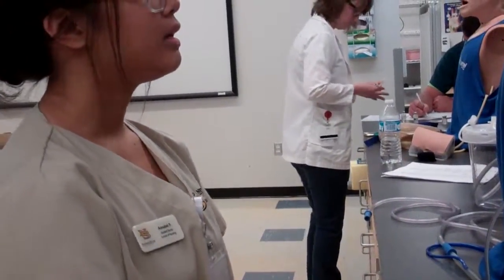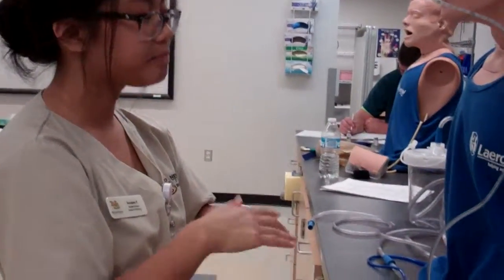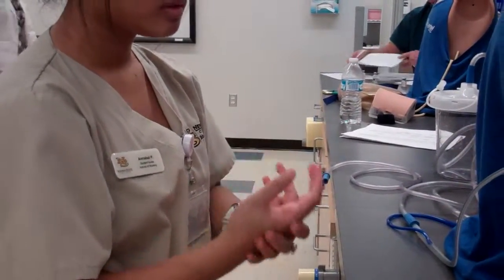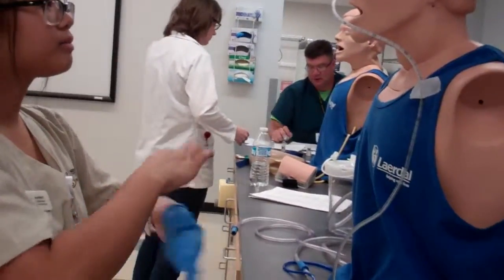Okay, so now I have a new order for my patient to have the removal of the NG tube, so now I'm going to demonstrate that. Come in. Hello, I'm Annabel, I'm a student nurse from Nevada State College. Can I have you verify your name for me, please? David Schumer. And your date of birth? 1/10/63. Okay, and that matches. So today we're going to be removing your NG tube.